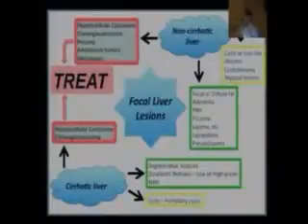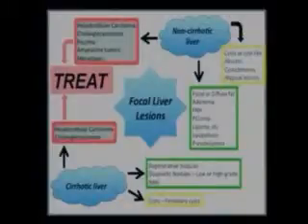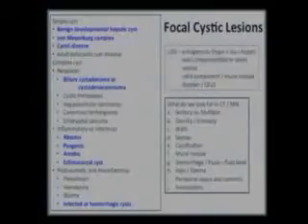So our primary interest, when a patient comes to you on cross-sectional imaging, is what kind of lesion are you looking at? Is it focal? Is it diffuse? If it's focal, is it cystic or is it solid? And that's what your sonologist comes in and tells you straight away, that you have a focal cystic lesion or a solid lesion. So let's take it that your sonologist has done a scan, you have focal cystic lesions.